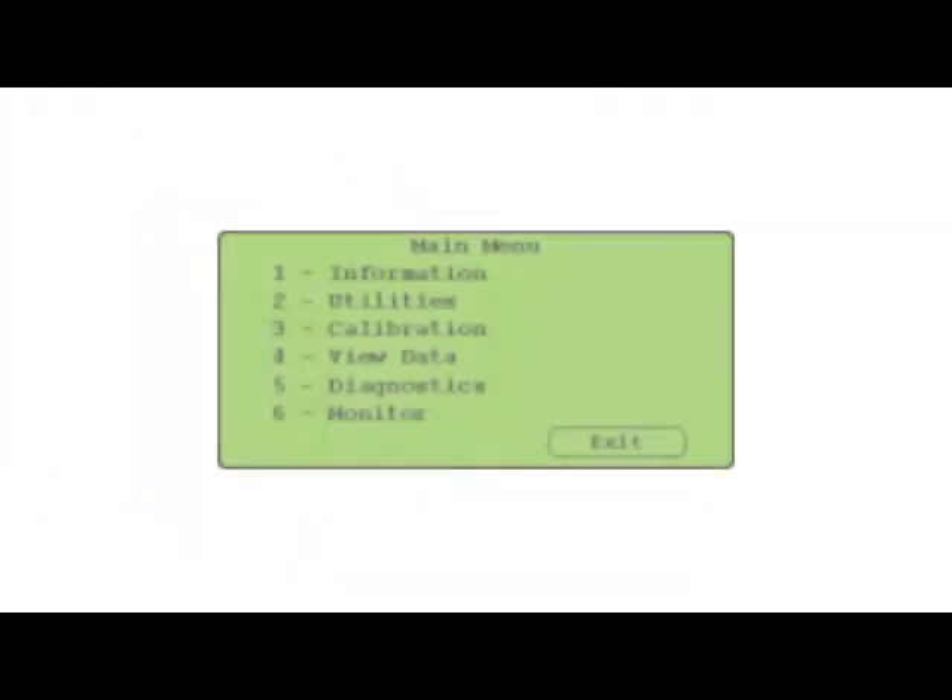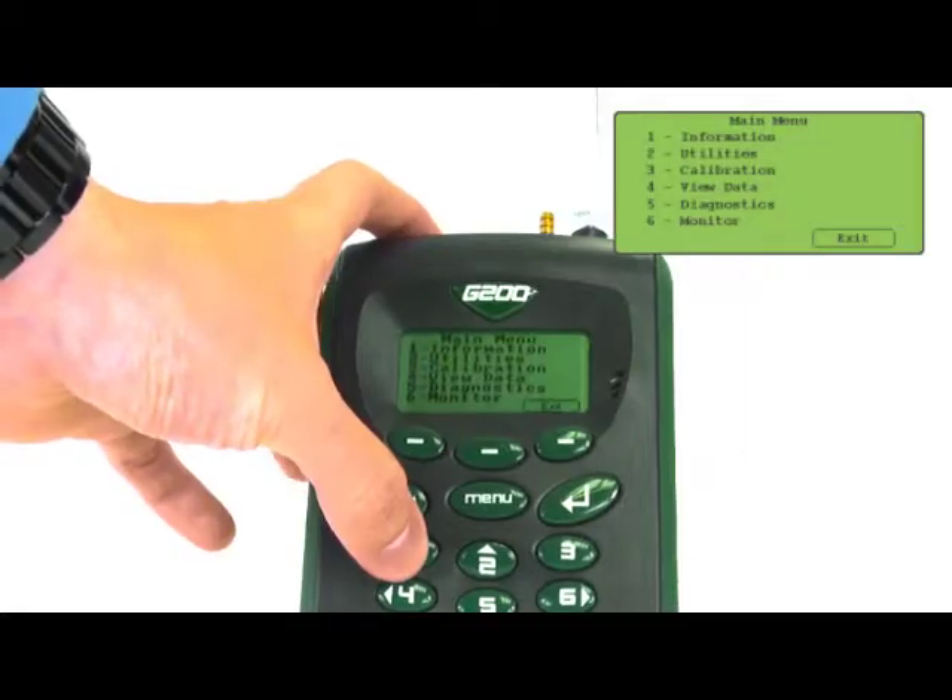There are six options: information, utilities, calibration, view data, diagnostics, and monitor. Information gives you details on the version software, serial number, and when the monitor is due to be serviced. It also shows the last factory calibration and user calibration dates.